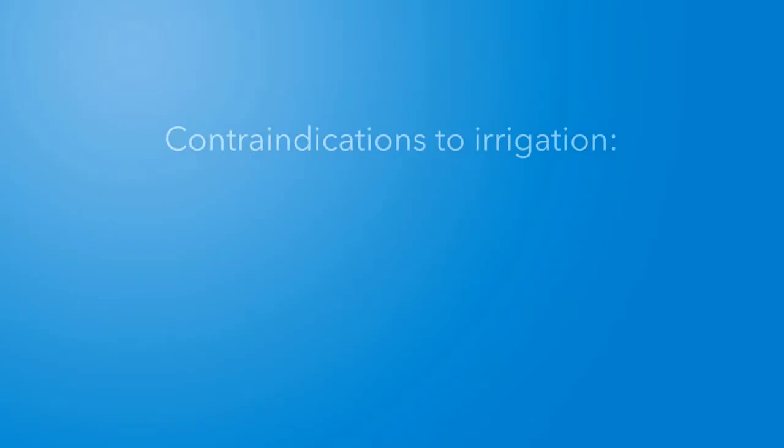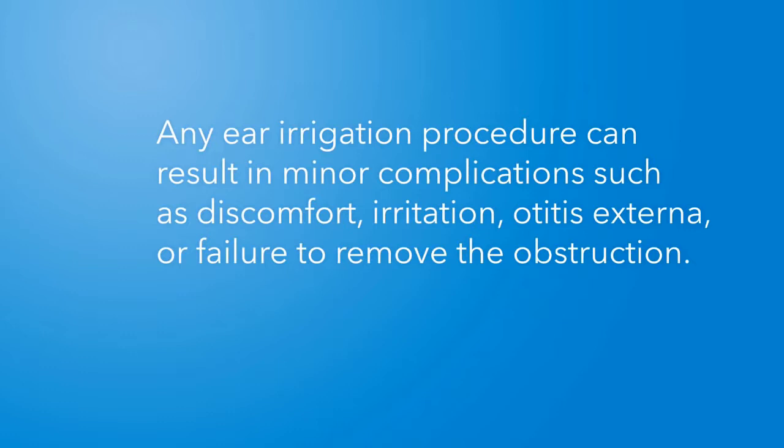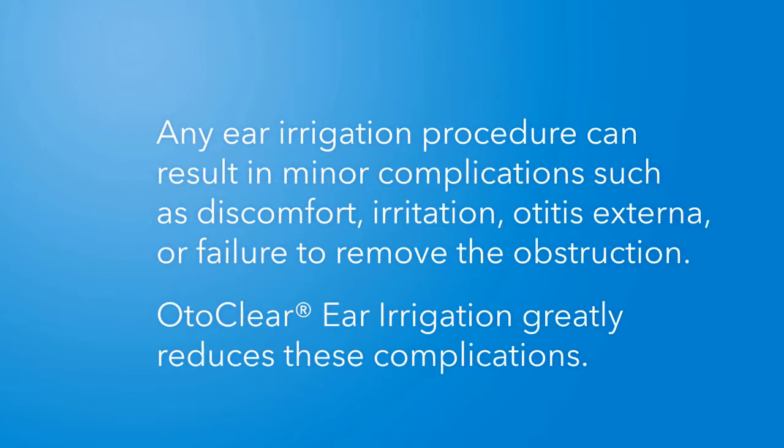Do not attempt ear irrigation if the patient has tympanostomy tubes or has a known or suspected eardrum perforation. The presence of infection, otitis externa or otitis media, is a relative contraindication, and the risks and benefits of irrigation should be considered before treatment.